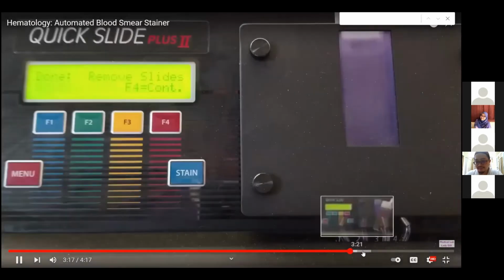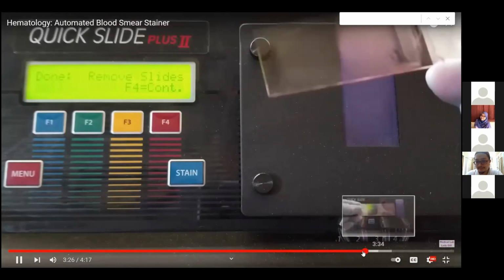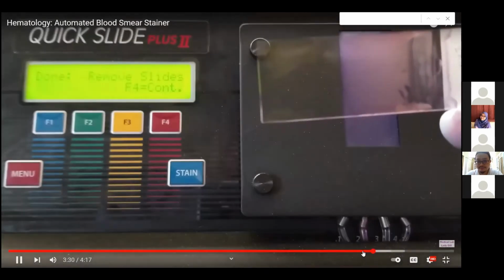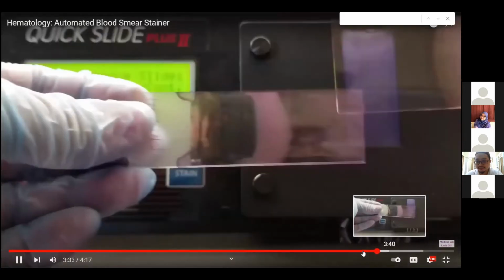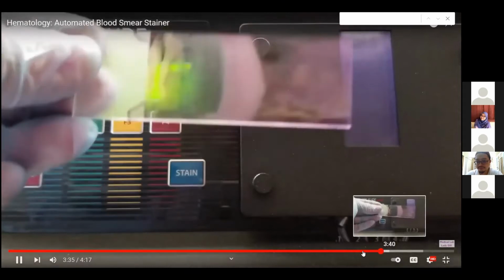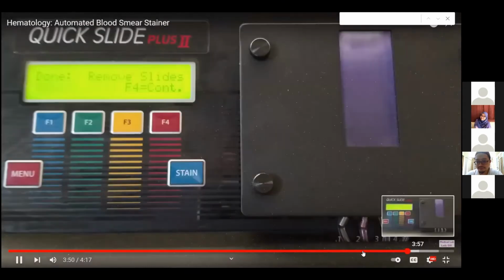Now, okay, I did not cancel it. So if it's been sitting for a while and you have not primed it before you start, you'll get a slide that looks like this, and that's not good. Not evenly distributed. Finally, you would then move on to your microscope.